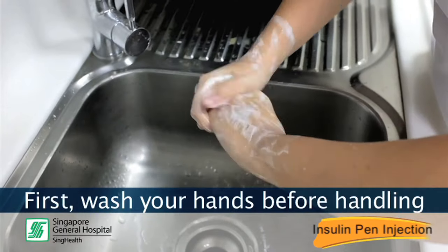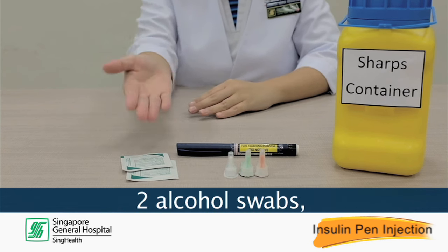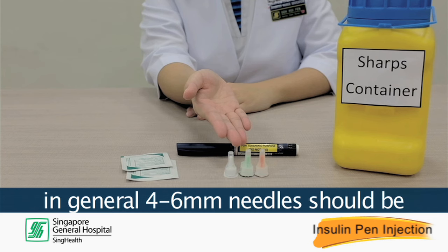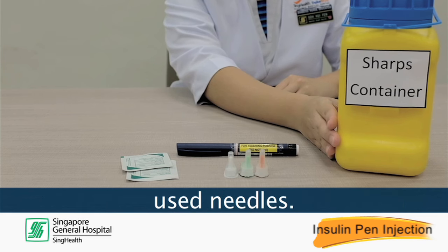First, wash your hands before handling the insulin pen. Each time you are given an insulin dose, you will need to prepare 2 alcohol swabs, an insulin pen needle — pen needles come in different lengths, and in general 4-6mm needles should be sufficiently long — and a hard container for the disposal of the used needle.